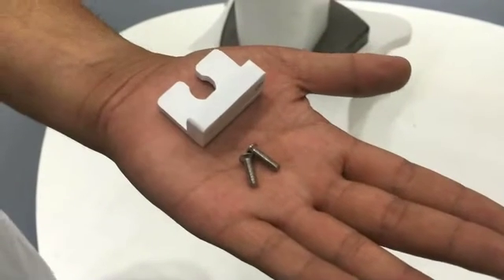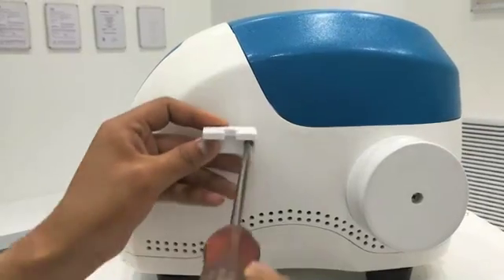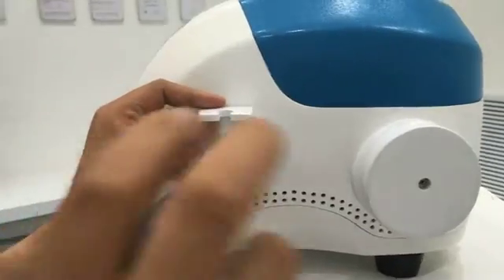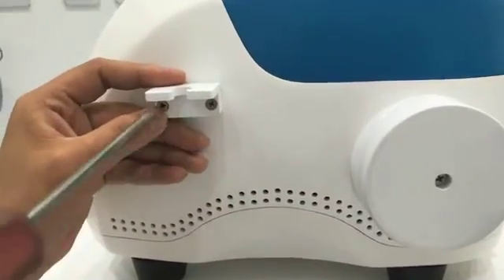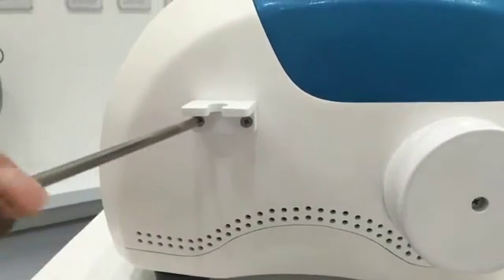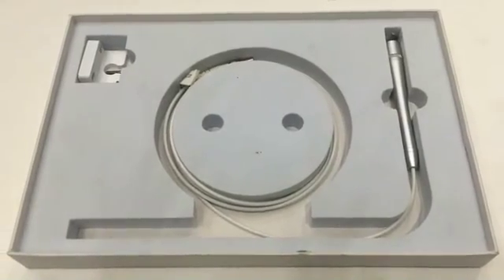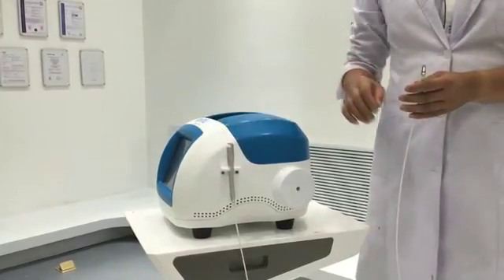Installation. Take out the main unit, then install the handle support using a cross screwdriver. Tighten screw hole alignment with the screwdriver. Install the handle, aligning the handle with the equipment. Press it gently and screw it tightly.